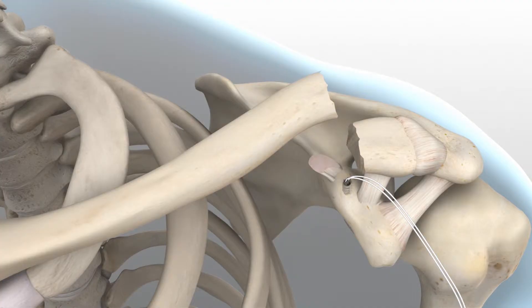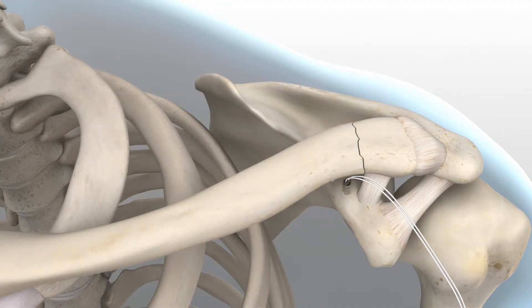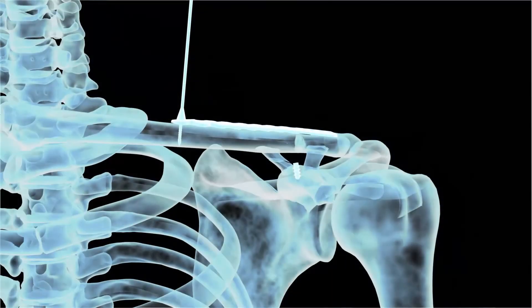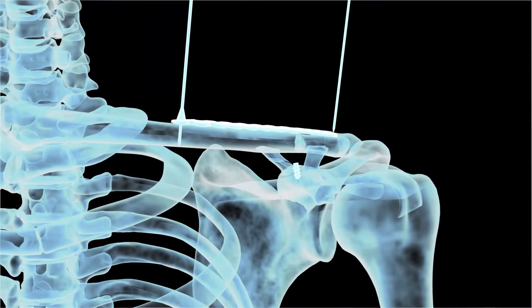Reduction of the fracture can be achieved provisionally by placing K-wires through the acromion or posterior scapula spine. Once the plate's ideal positioning has been achieved, it is provisionally stabilized to the clavicle with plate tacks. Under radiographic evaluation, place a 0.059 inch K-wire through the designated K-wire hole at the far distal end of the plate to ensure that the plate does not infringe upon the AC joint.